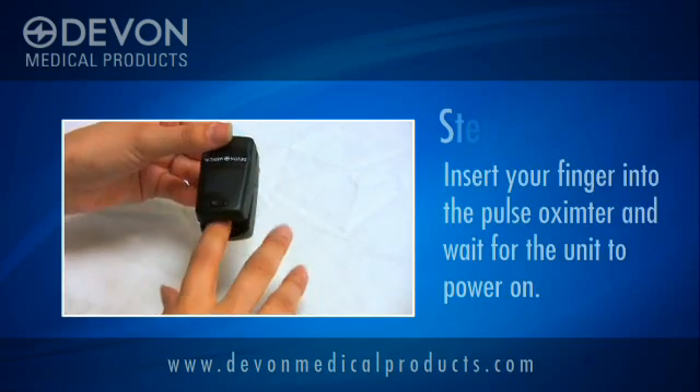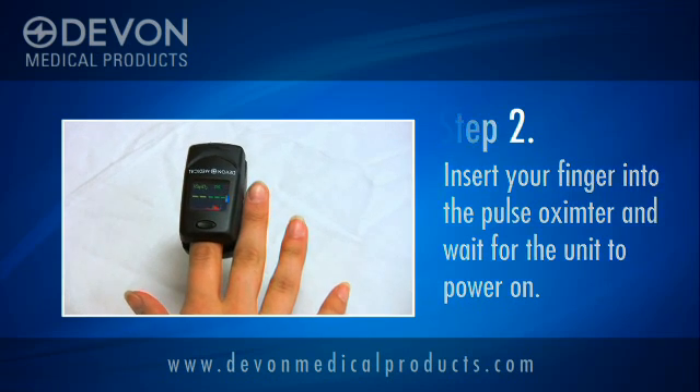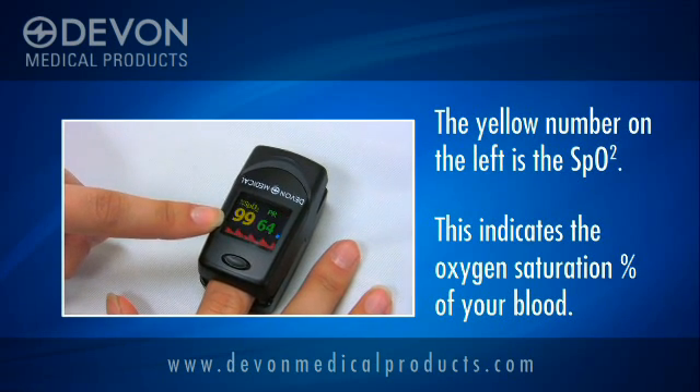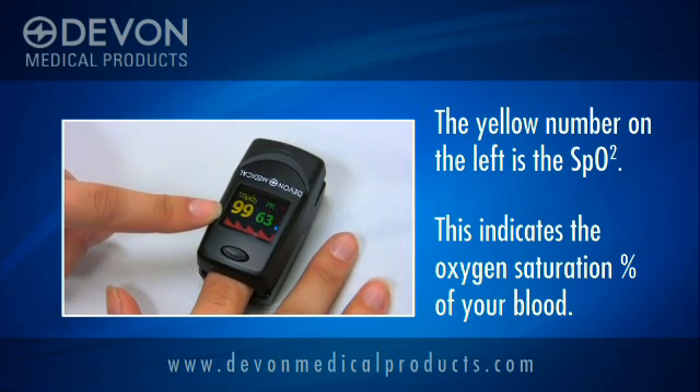Once ready, insert your finger into the pulse oximeter and wait for the device to power on. After about five seconds, you will see the readings appear. The yellow number on the left is the SpO2, which is the percentage that shows the level of oxygen saturation in your blood.